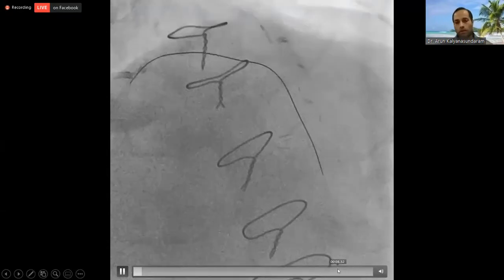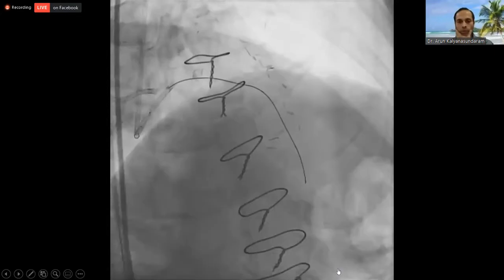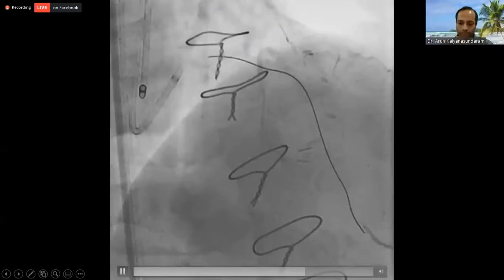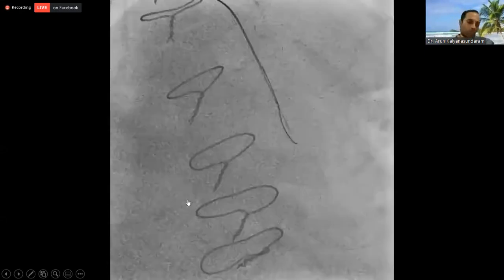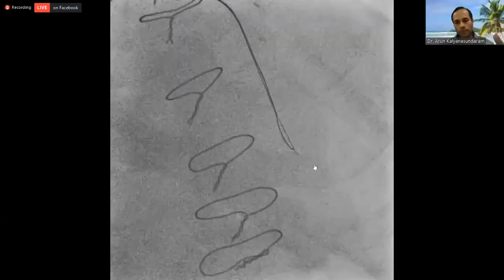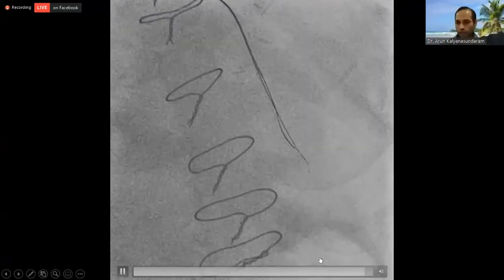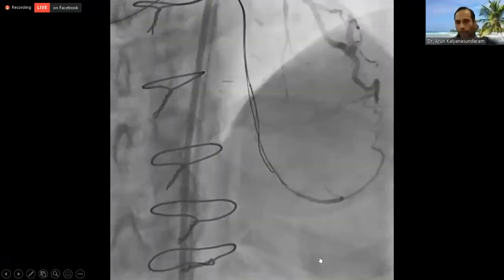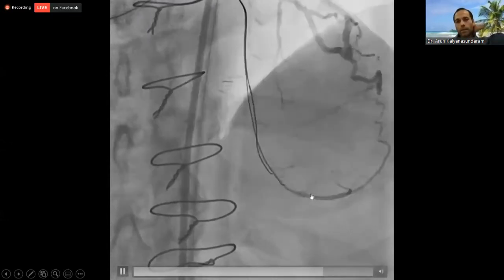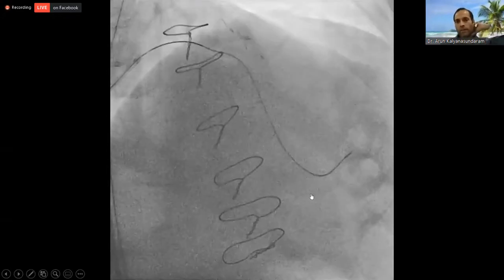So now what are your options, right? You can either go retrograde or you can do what we used to do before the Stingray balloon came about, which is take a dual lumen catheter. I did use a dual lumen catheter here and did essentially parallel wire. That's the wire going in, confirmed position. As you can see, that's the dual lumen catheter, and this is the second wire in there. Confirm position again, exchange for a workhorse wire, final result.